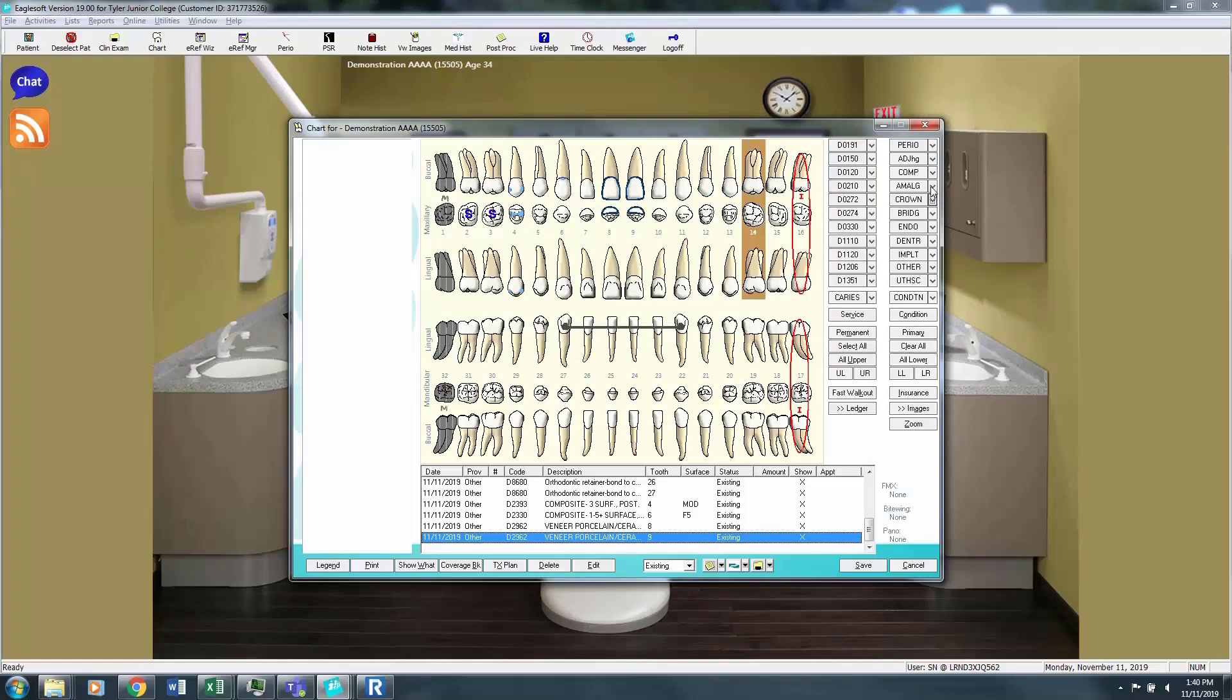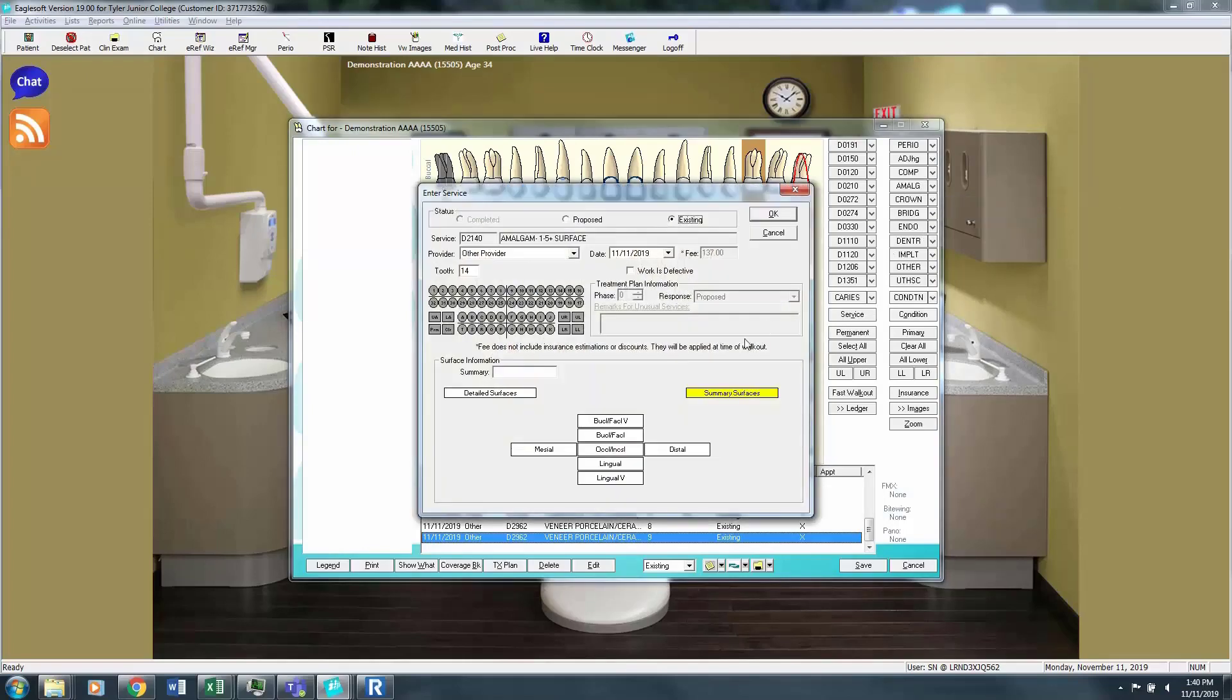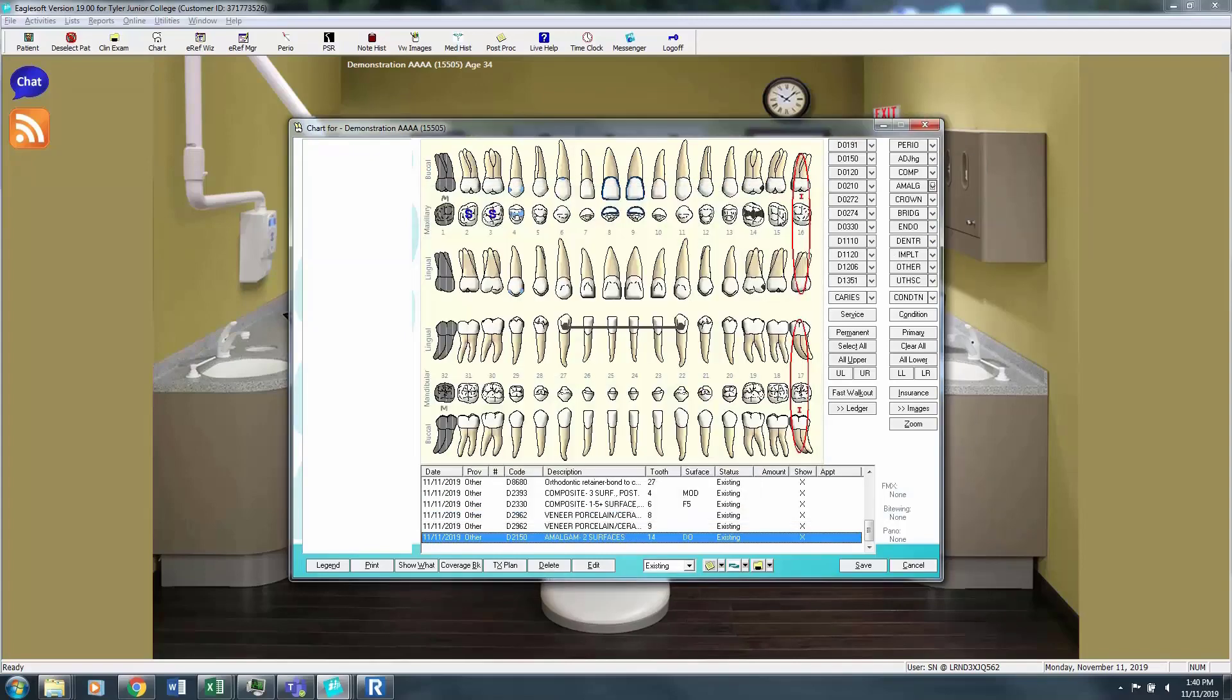We will say that tooth number 14 has an amalgam filling. So you're going to choose the amalgam, and choose the surfaces, and existing.